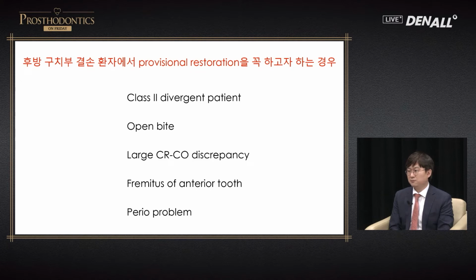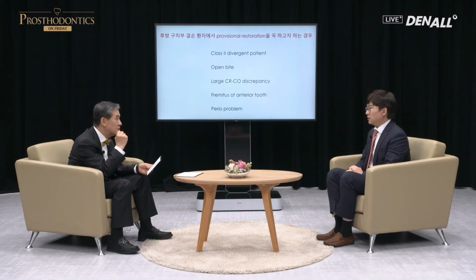Do you use a temporary for a patient with a heavy occlusal force? Yes.